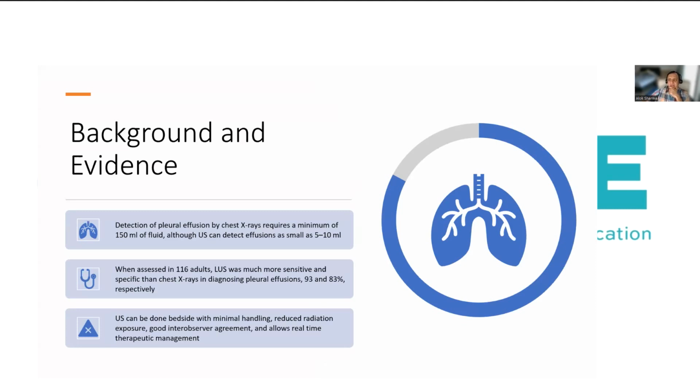Now, why and what is the background for the use of lung ultrasound in diagnostic radiology for detection and management of pleural effusions? Well, the first thing I would like to say is that in a large number of situations, when we review chest x-rays, we don't see effusions at all. When you do the ultrasound, you're able to detect small pleural effusions. A lot of people will argue that they're small and they're not going to cause symptoms. So what is the clinical significance of being able to do that?